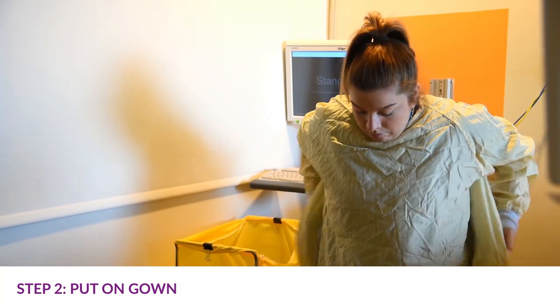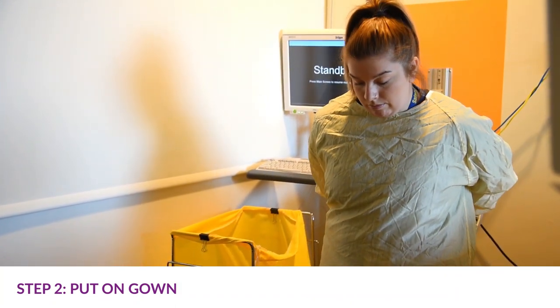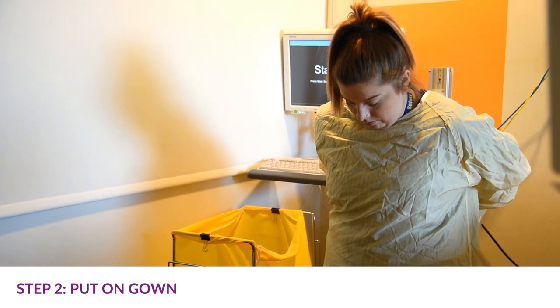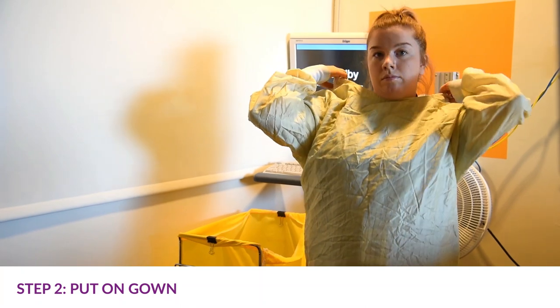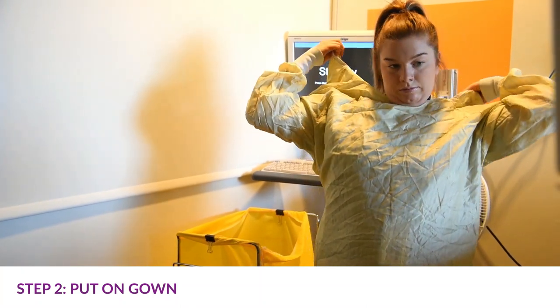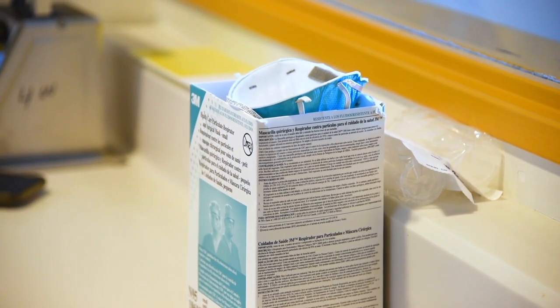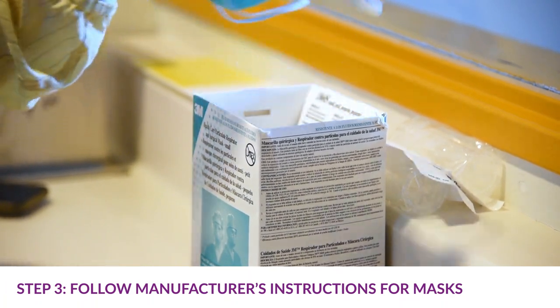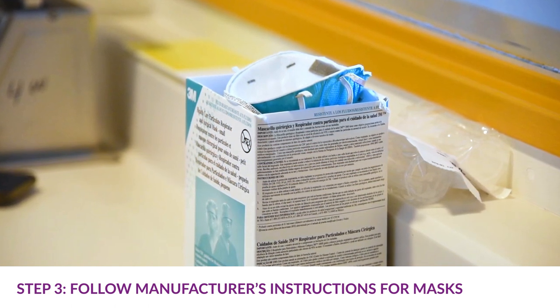Carefully inspect the gown to make sure it's clean. Tie the gown, making sure it covers from neck to knees to wrist. Tie at the back of the neck and waist.